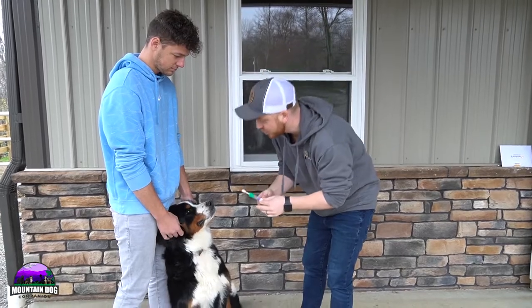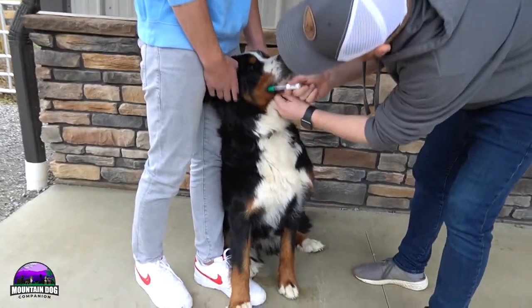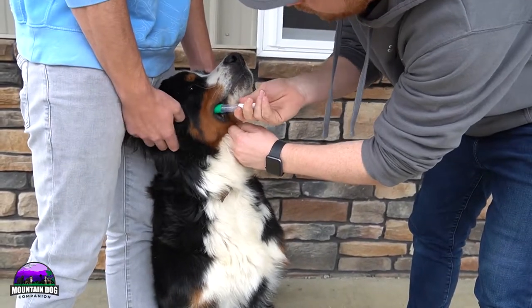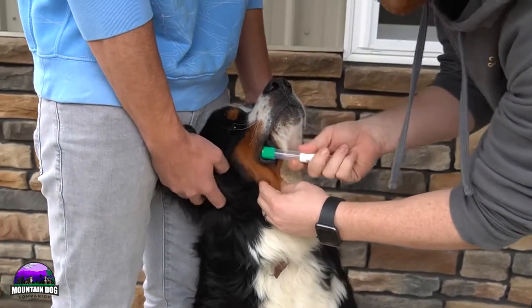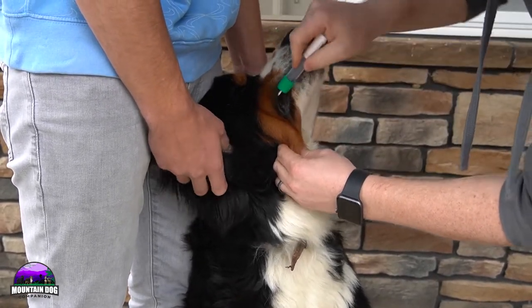And we'll show you how that's done. So I'm going to go all the way back — swab. And I'm going to do this for about a minute, guys, both sides. Get deep in there.